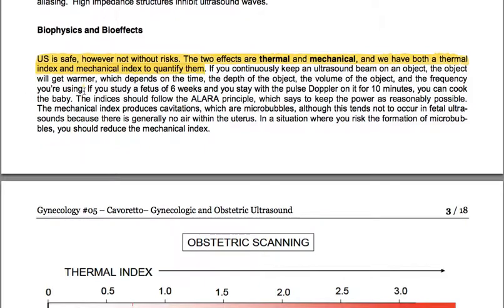The indices should follow the ALARA principle, which says to keep the power as low as reasonably possible. The mechanical index produces cavitations, which are microbubbles, although this tends not to occur in fetal ultrasound because there is generally no air within the uterus. In a situation where you risk the formation of microbubbles, you should reduce the mechanical index.